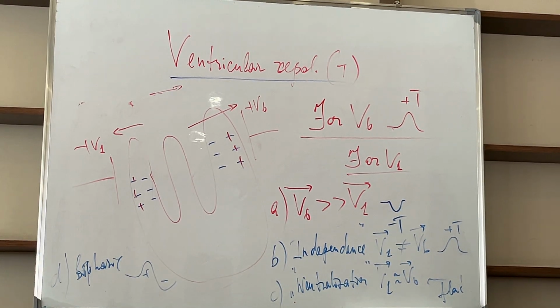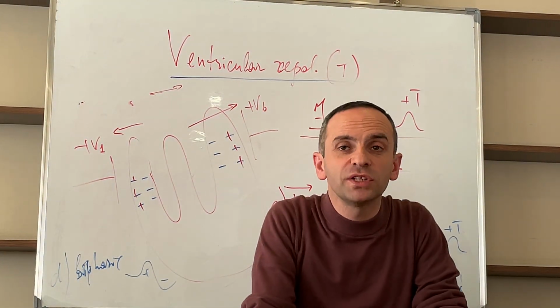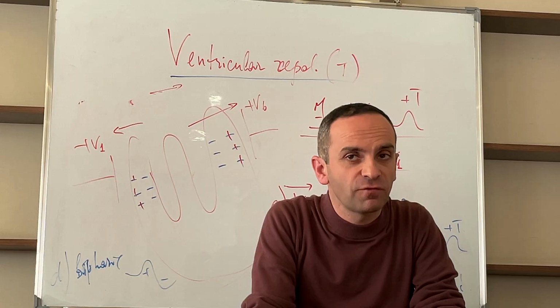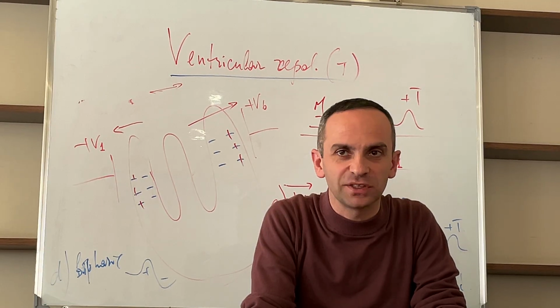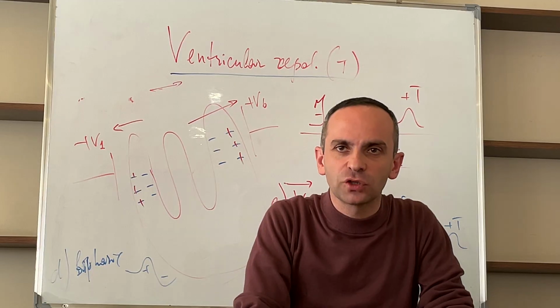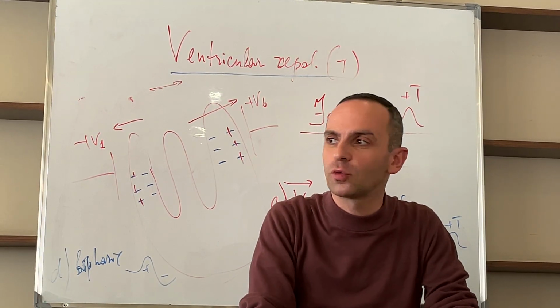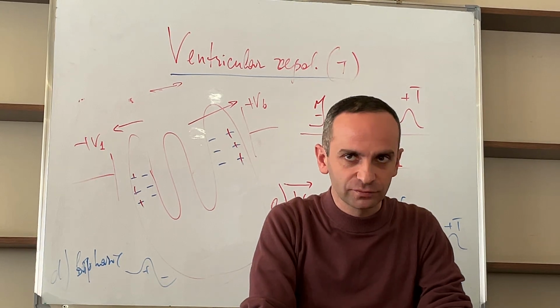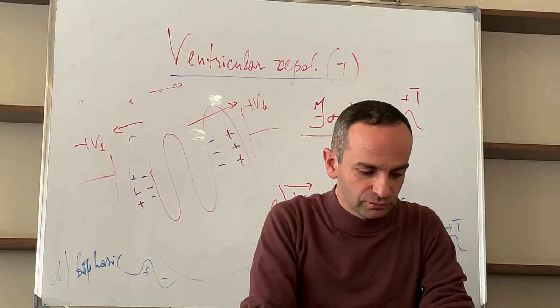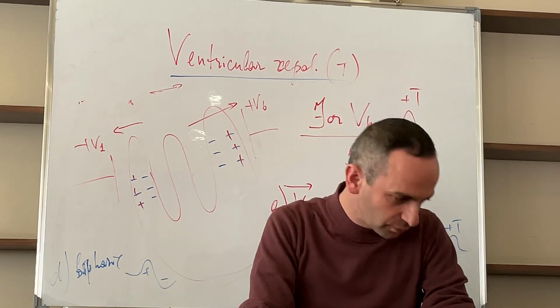So, summarizing, for V1, T wave may be positive, negative, flat, and biphasic, normally. And when we are speaking that QRS, R is always positive, Q and S always negative, it is in all cases, no pathology. And that P wave may be biphasic, already you understand.